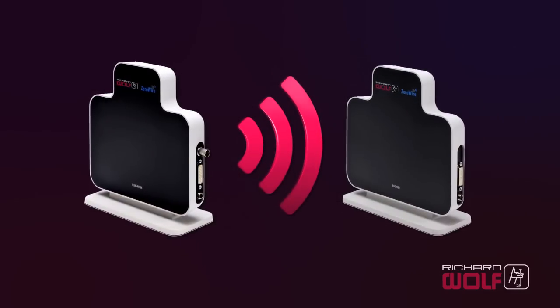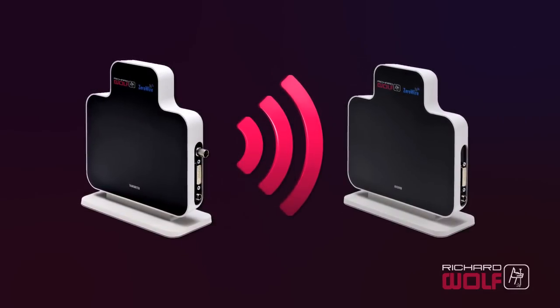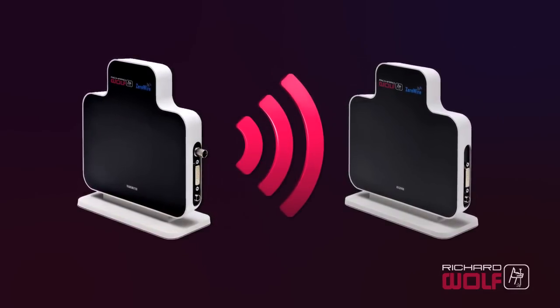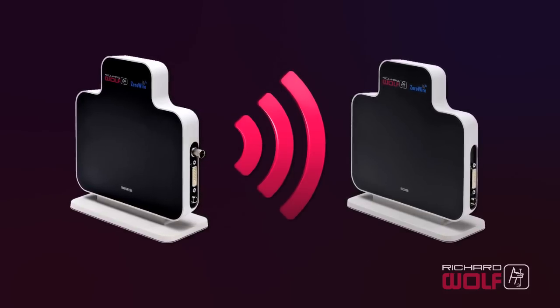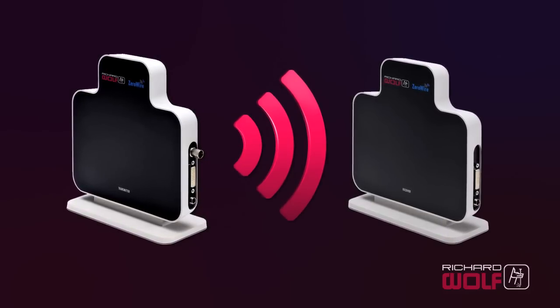With ZeroWire, you no longer have to imagine all of these benefits. High-quality HD video with improved efficiency, safety, and flexibility is now a reality. Experience wireless technology in the OR.